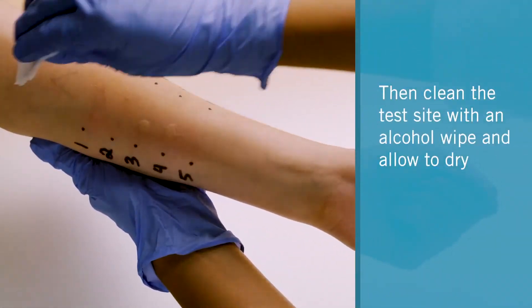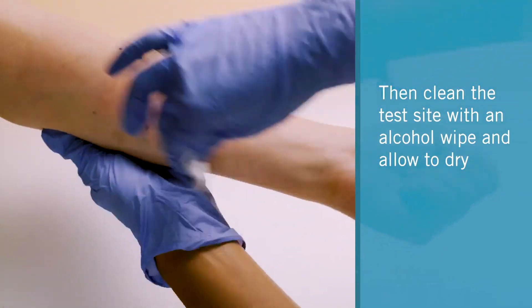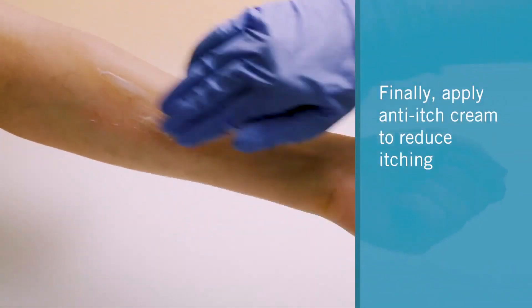Clean the test site with an alcohol wipe and allow to dry. Finally, apply anti-itch cream to reduce itching.